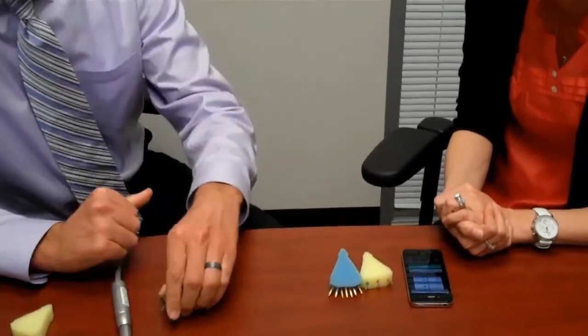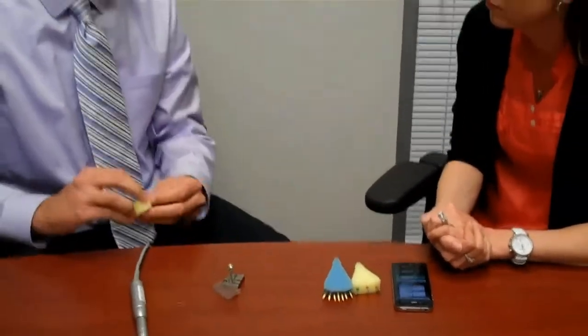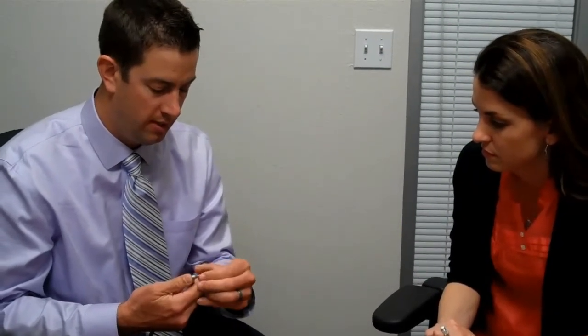This is kind of the torture test that a lot of published studies on rotary files use — the same thing they do, obviously in a lab setting. So now I'm going to use the Twisted File 06/25, which is the equivalent to the ProTaper, running at the same speed and going into the same canal.